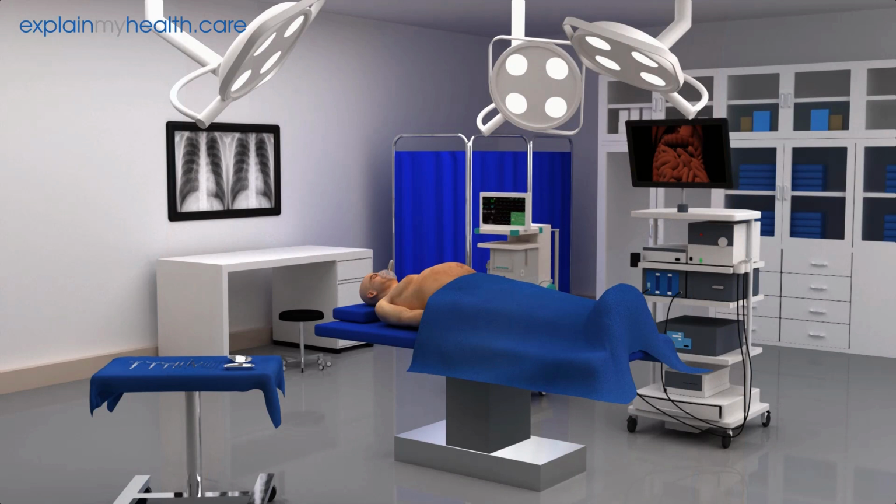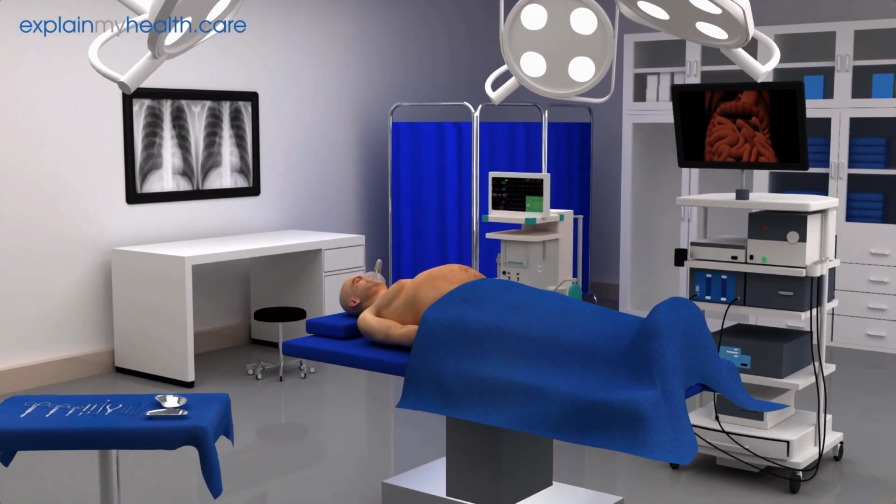Laparoscopy is a type of surgical procedure that allows a surgeon to access the inside of the belly and pelvis without making large incisions in the skin. It's also known as keyhole or minimally invasive surgery.